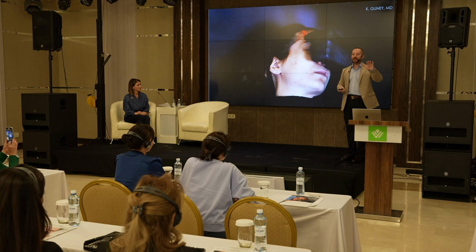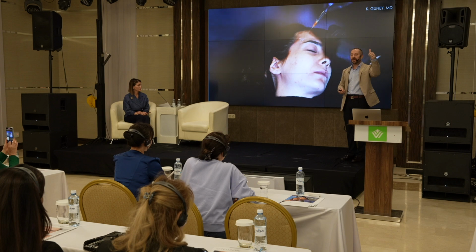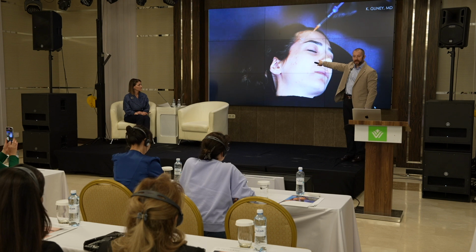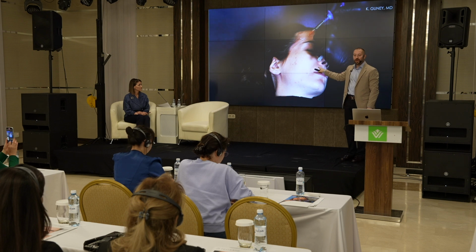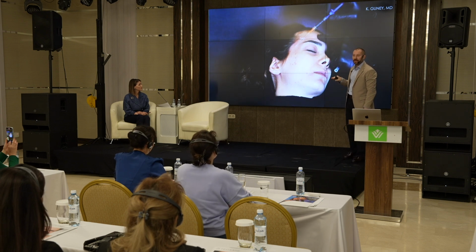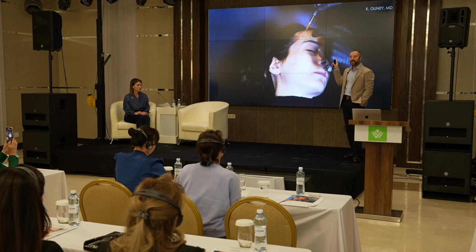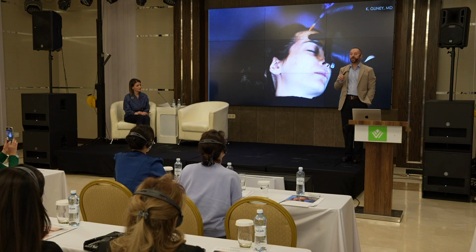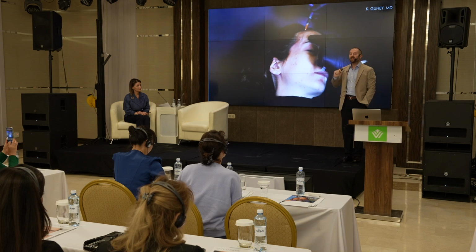So the layers, I will tell you what the injection layers are. Deep to the bone, gunshot technique, subcutaneous injections, as you see here, subcutaneous superficial injections. You can see my cannula, how superficial it is, but this is the danger area because our artery is in this area. So you have to inject with a cannula, and the product is important. In this area, we shoot a product like RH2, a really soft product, because it can cause irregularities.